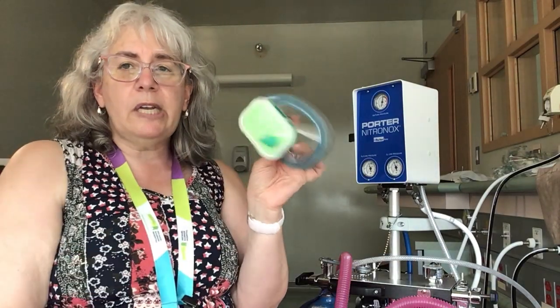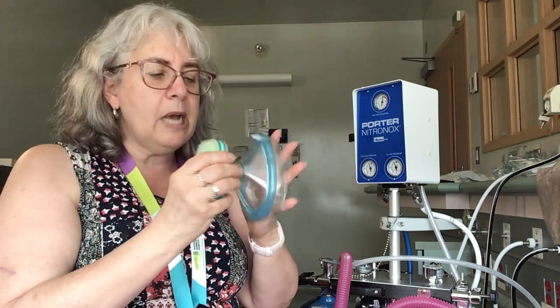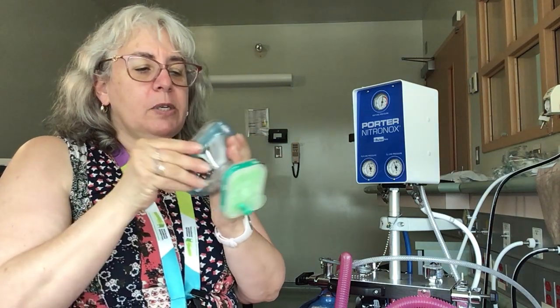Patients with acute respiratory infections or respiratory disease, and patients who have undergone jaw surgeries or facial injuries which prevent them from obtaining a good seal with a face mask. That is a key feature right now, and this actually is the face mask with the filter. I've just taken it off the unit because right now the unit is open and I don't want to breathe in the gas, but they have to maintain a really, really tight seal, which is really important.